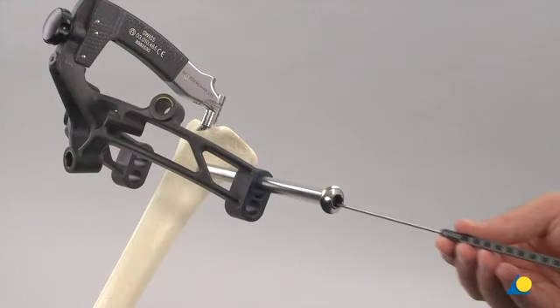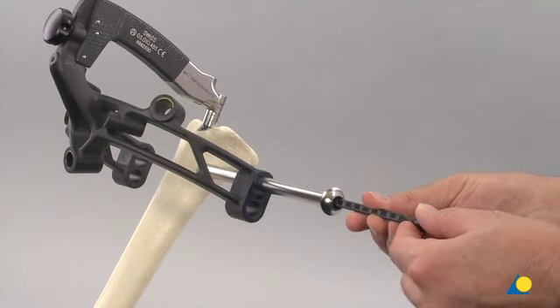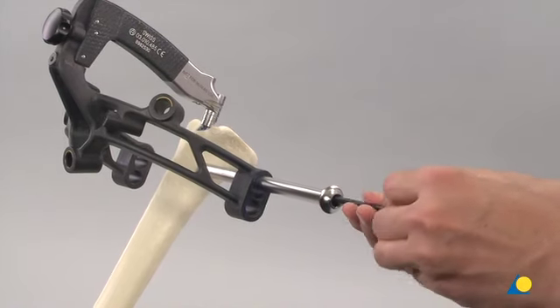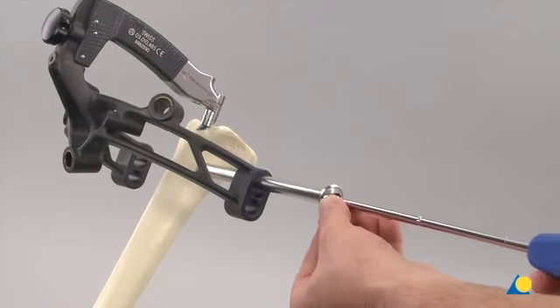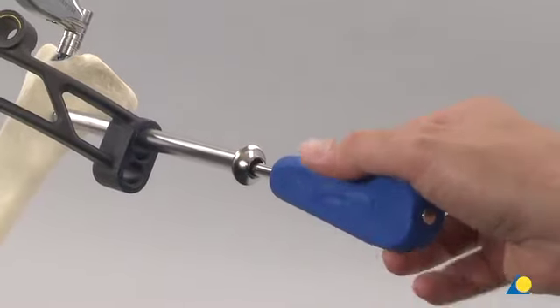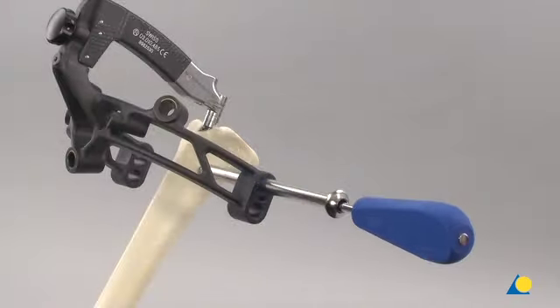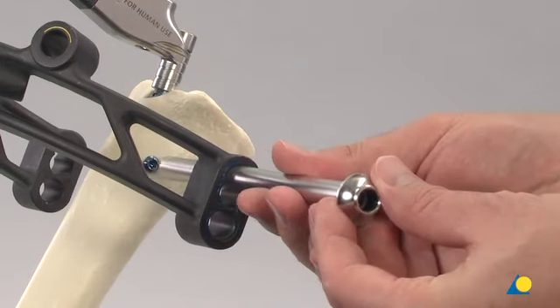While ensuring that the protection sleeve is pressed firmly to the bone, the measuring device is slid through it, making sure that the hook grasps the far cortex. The length of the first locking screw is read from the measuring device at the back end of the protection sleeve. The 4.0 locking screw is inserted through the protection sleeve and threaded into the hole with the screwdriver Star Drive T25. The screw length is verified under image intensification. The tip of the locking screw should not project more than 1 to 2 millimeters beyond the far cortex. After the length of the screw has been verified, the screwdriver and protection sleeve are removed.